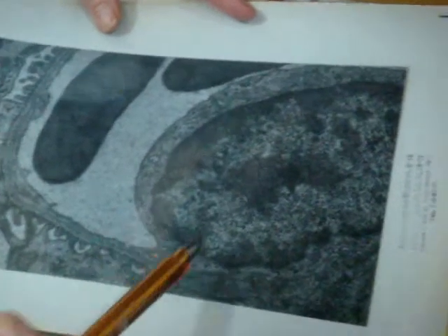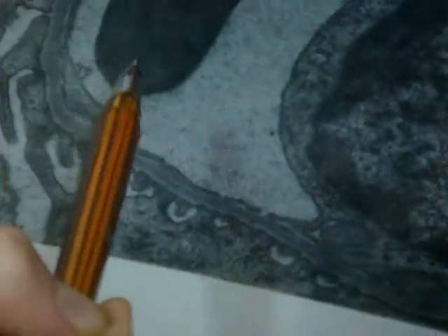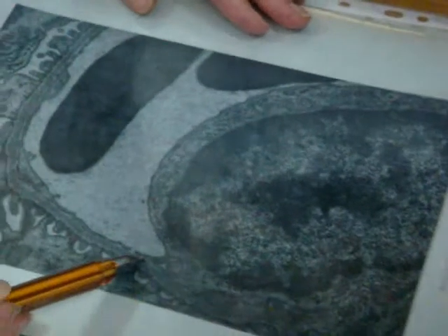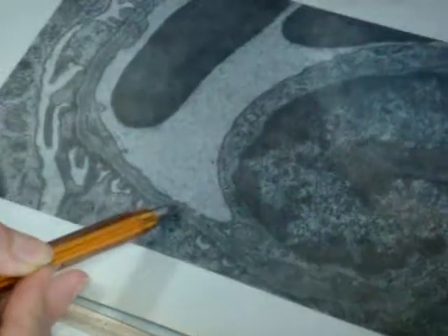Okay, what can we see here? Yes, you're right. Look please, we can see a very thick basement membrane. Such a thick basement membrane we can see only in the glomerulus of the kidney. Okay? So, look please, this is the lumen of a blood vessel. And what type of blood vessel? We can see fenestrae, a fenestrated blood vessel.